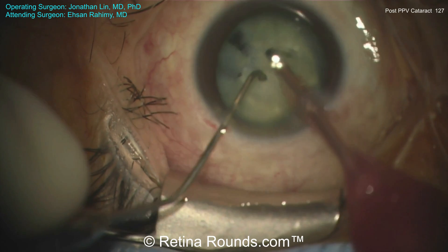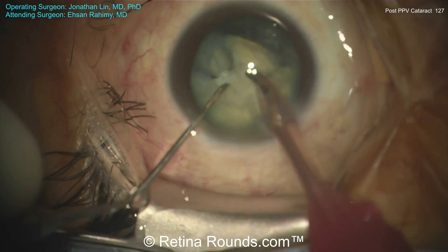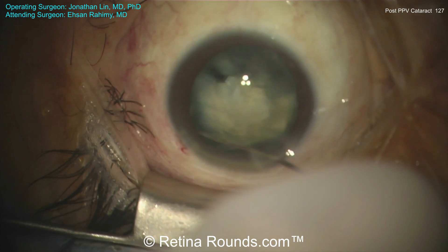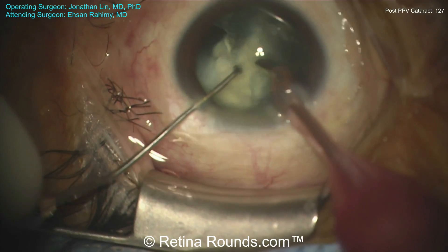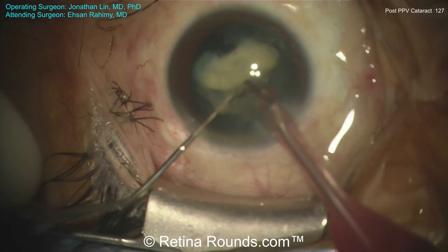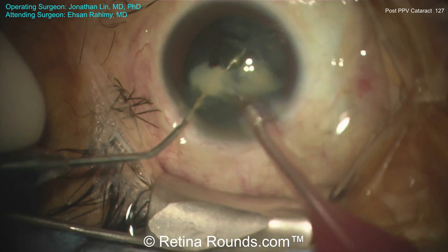Using the phaco probe and the chopper, lens material is being broken up into smaller pieces and removed. As some of these pieces are removed, you can see that there is in fact a posterior capsular violation. Some viscoelastic is being used here as a barrier. Unfortunately, that viscoelastic has pushed one of those fragments into the posterior segment, which will have to be addressed later. One strategy is to use the viscoelastic to get underneath the lens fragments rather than pushing on top of them, to decrease the likelihood of lens material migrating into the posterior segment.